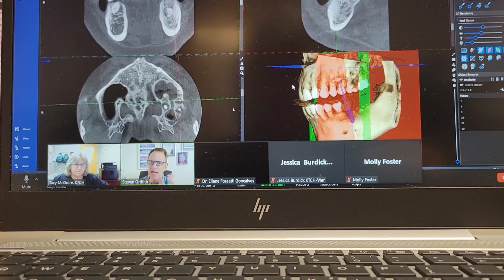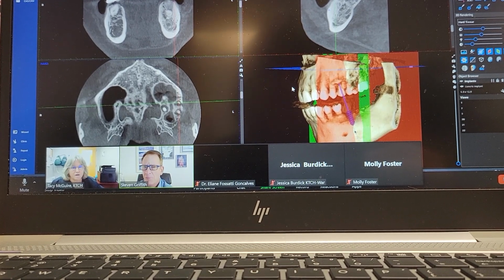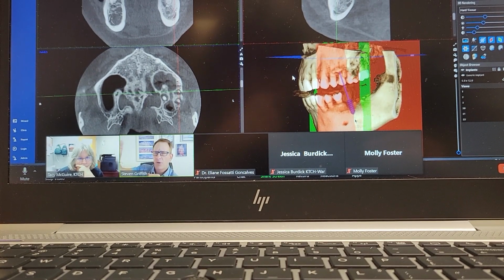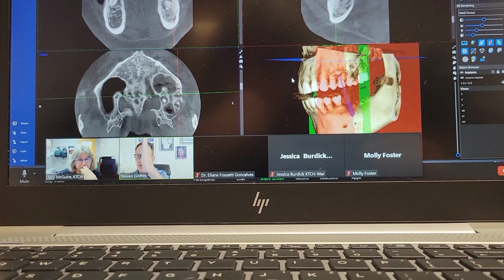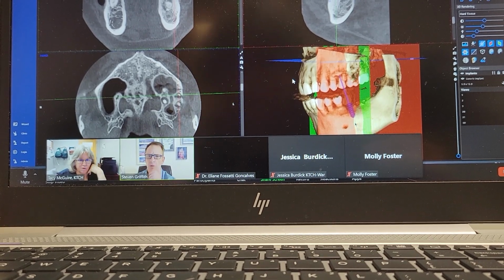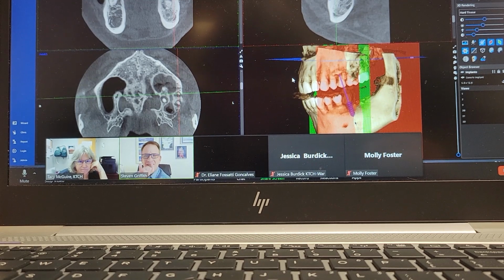You can click that, and nine different little boxes appear. The top is for a small arch, medium arch, and then large arch, and going this way, it is narrow like a V, horseshoe, and then square.